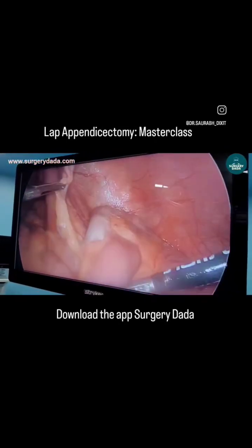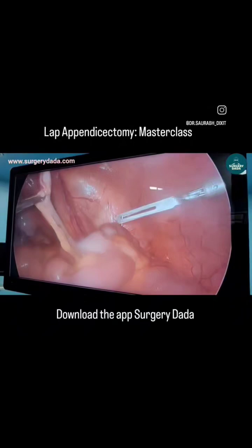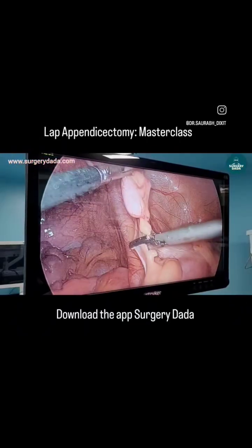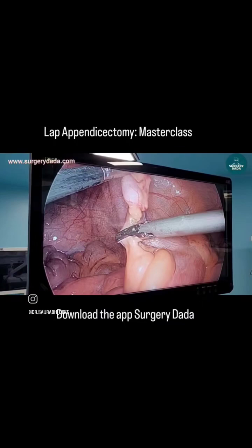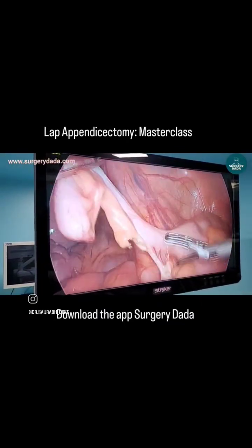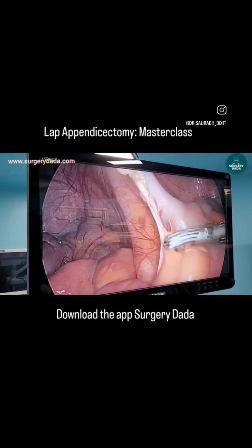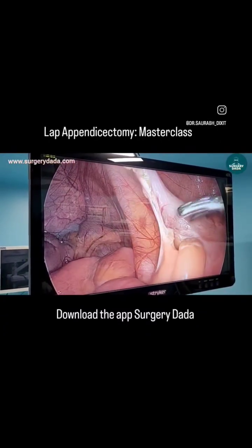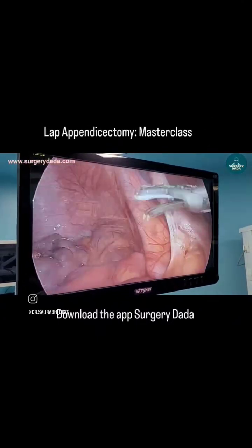Welcome to Surgery Dada. I'm demonstrating the steps of laparoscopic appendectomy. You can see I'm holding the appendix with an atraumatic grasper. The most important step is to secure the meso appendix. When securing and dividing it with a bipolar or harmonic grasper, you should always be alert about an accessory vessel. That is why you should always trace the white tissue, which is a surgeon-friendly tissue.